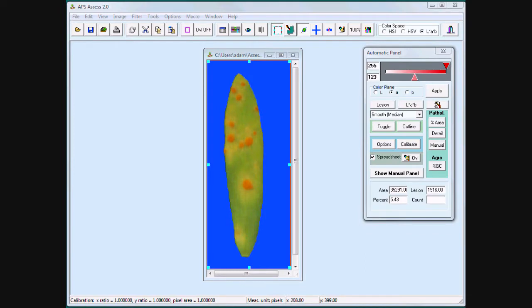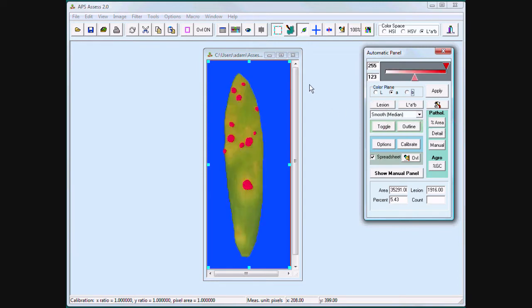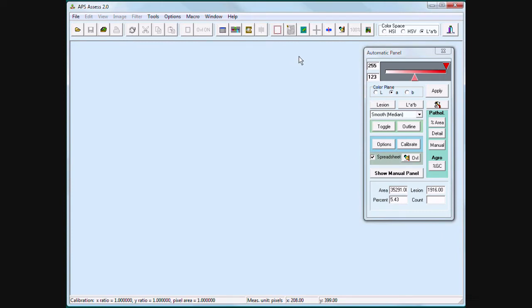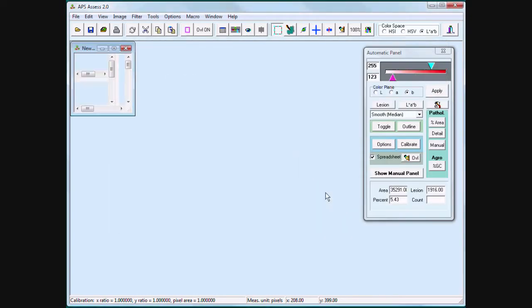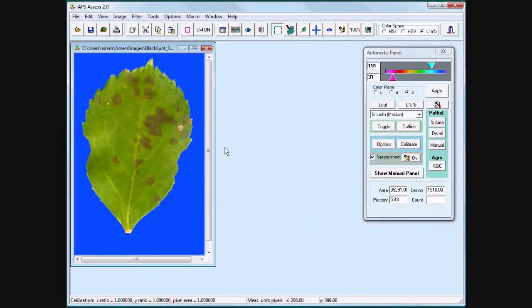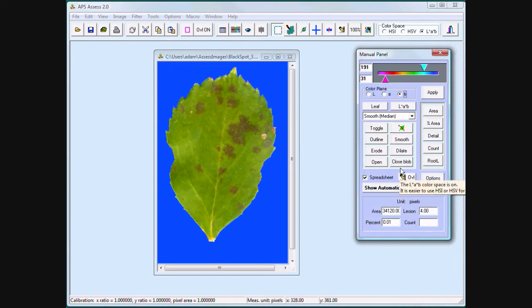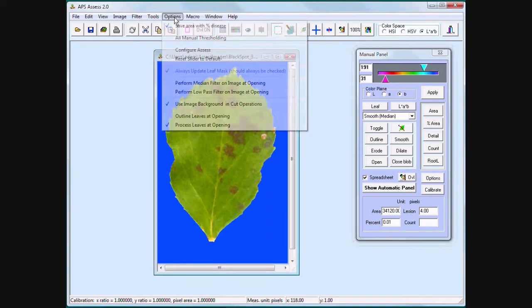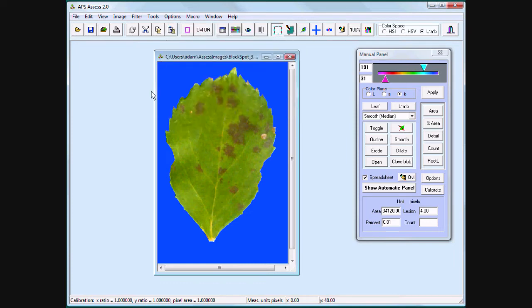Assess 2 can automatically threshold many leaf lesion combinations. But when all else fails, Assess still offers the opportunity to manually threshold. I will show the manual panel and activate an option called All Manual Thresholding. All Manual Thresholding allows the user to manually select and individually threshold each and every lesion.